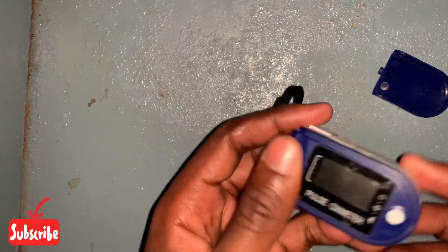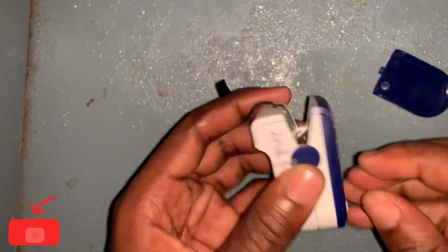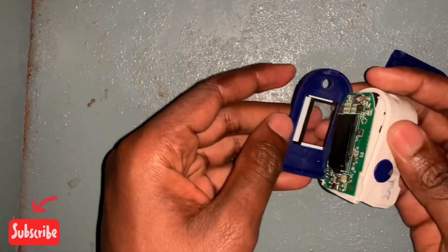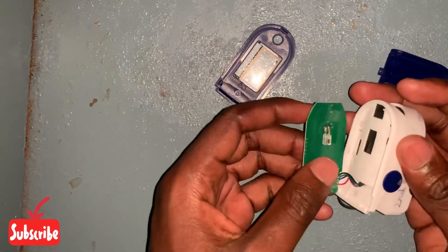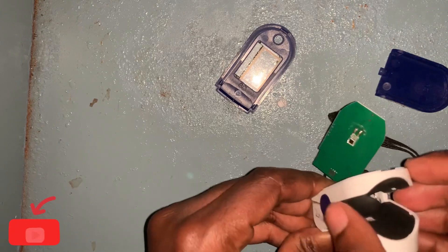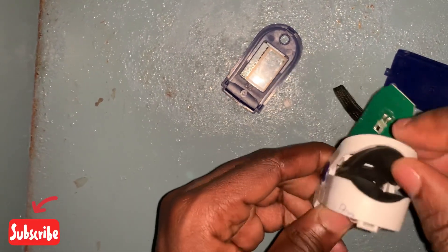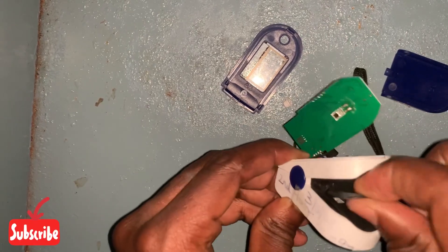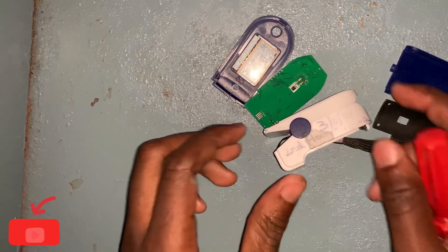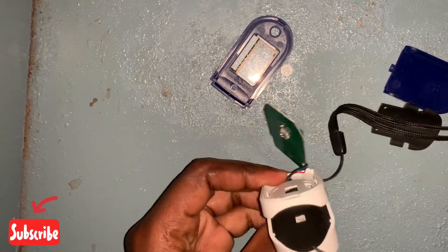Let's begin. First of all, let us remove this top cover. As you can see, we have removed the top cover. Next, we will remove this layer that is here — this is like a protective covering. Here I have my screws, and I'm going to bring up this layer.